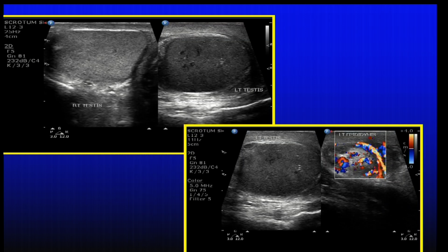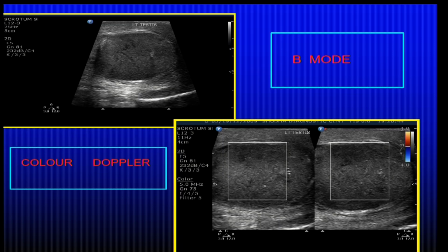You remember there is a rule in surgery that whenever you examine an acute abdomen, always expose the male patient fully down, because scrotal pathologies could be a cause of acute abdomen. See in this case again, the testis on the symptomatic side has hypoechoic, inhomogeneous areas; the other testis is normal. See the B-mode, see the color picture: no flow. What are we dealing with? Very good.